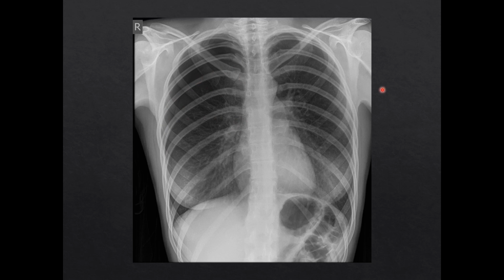Now, it's important to note that this is primarily true for an erect chest x-ray. If the patient weren't seated but were laying supine, then the air, instead of accumulating up in the apex, would accumulate in the anterior chest. And what that can often look like are these deep costophrenic angles on both sides.